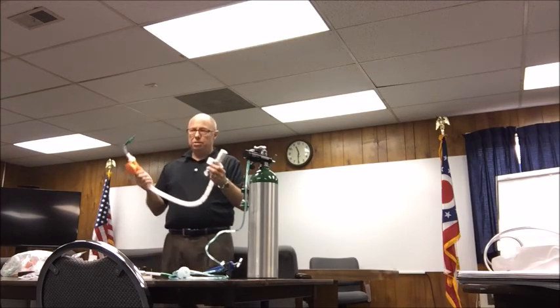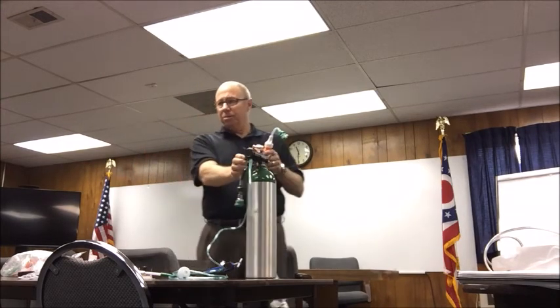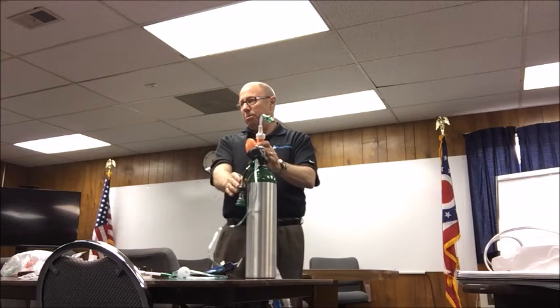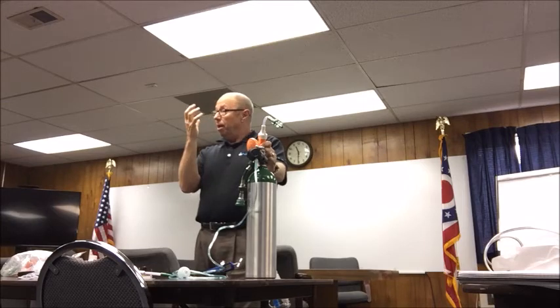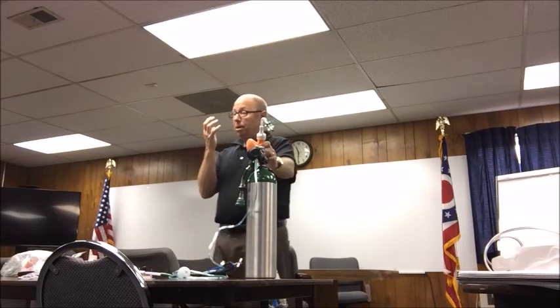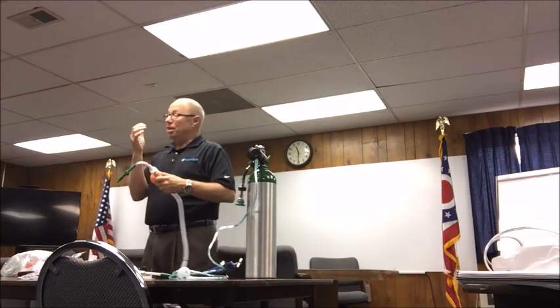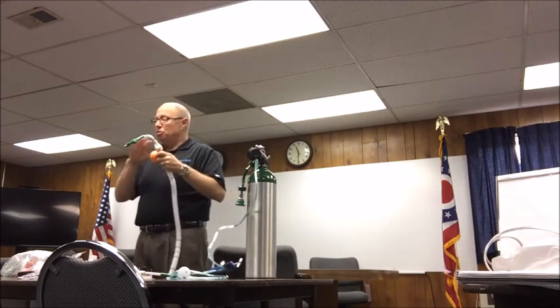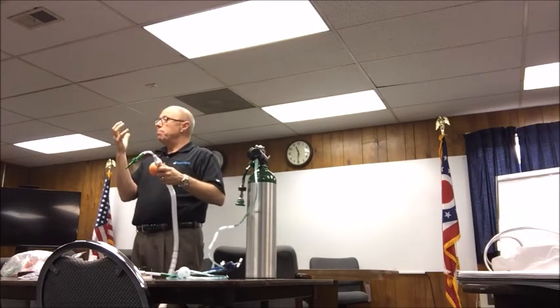Any questions about CPAP? The keys are high pressure. Got to use a high pressure, which you're all used to. Okay. Sizing the mask, reading glass level instead of eyeglass level. Not a lot of pressure on the mask. If it leaks, loosen it. That's just crazy to think about. If you're getting leaks in that mask, loosen the mask.